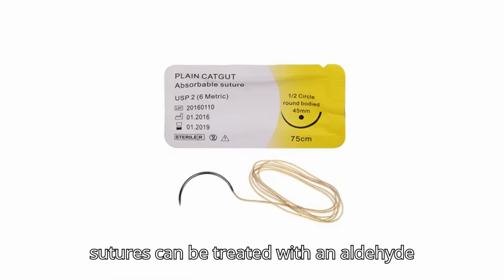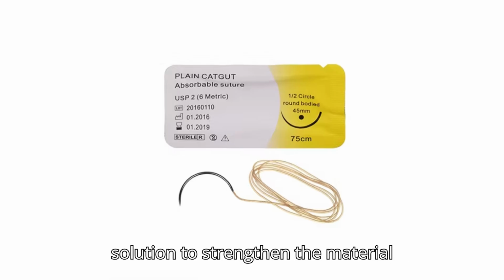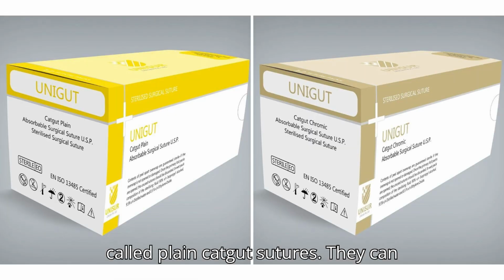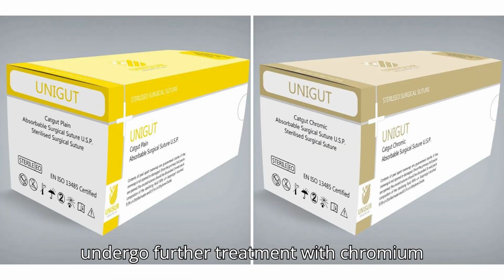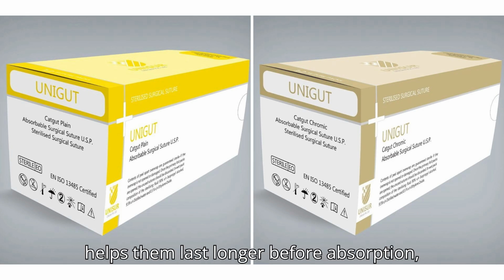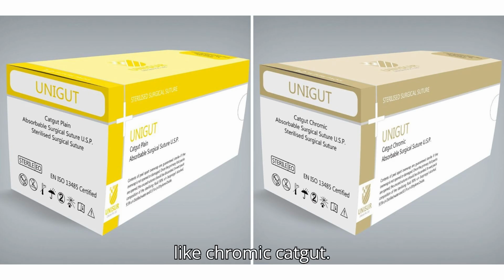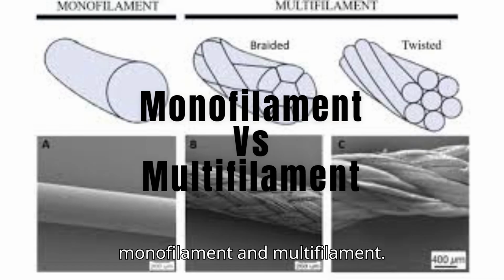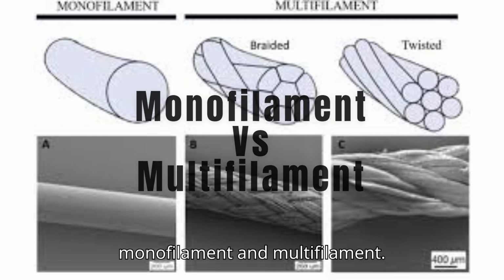Catgut sutures can be treated with an aldehyde solution to strengthen the material, called plain catgut sutures. They can undergo further treatment with chromium trioxide, which also strengthens and helps them last longer before absorption, like chromic catgut. Another important suture category is monofilament and multifilament.